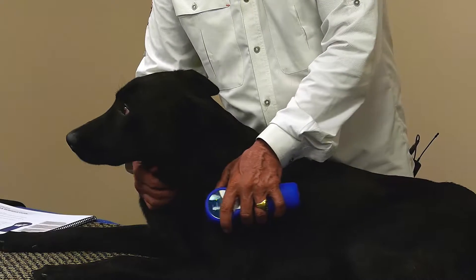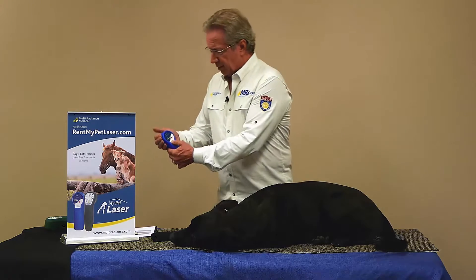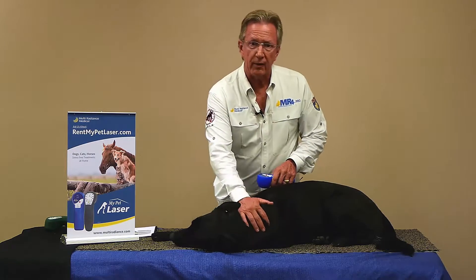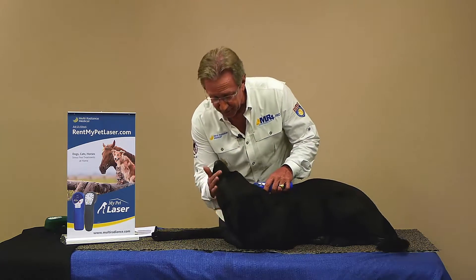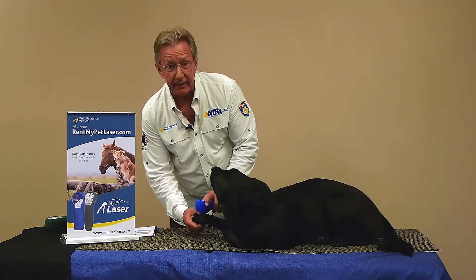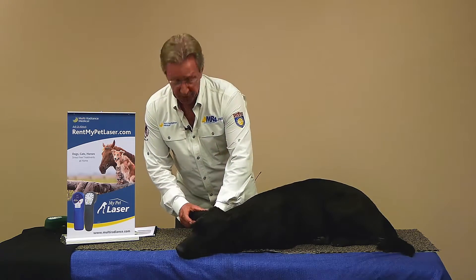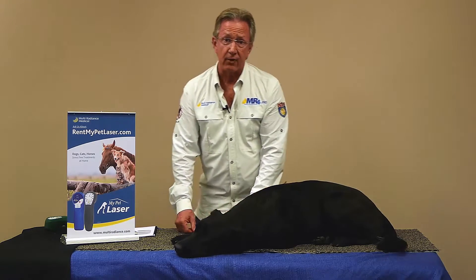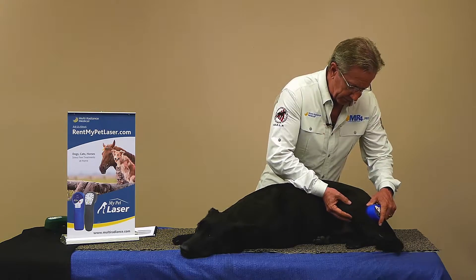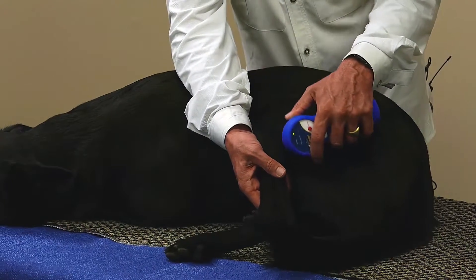Talk to your vet about the My Pet Laser Rental Program — it's so incredibly useful. The third setting: just push the power button and set it up to number one. Number one is our 50 Hertz, and that's when you have those joints with arthritis. You just treat around the joint radially, right around the joint, bending it slowly so that you're getting the energy inside that joint to the articular surfaces. That's where the inflammation lives in the case of arthritis. With the hips, much the same thing — just treat all around that hip, and especially spend time around the joint itself, then stretch that leg out to get inside those articular surfaces.